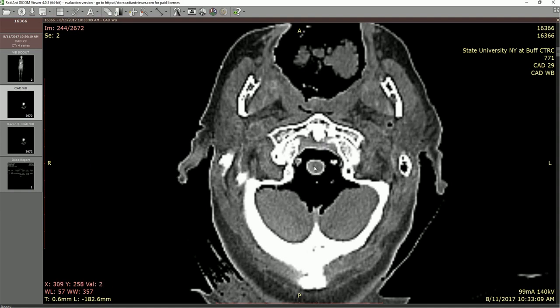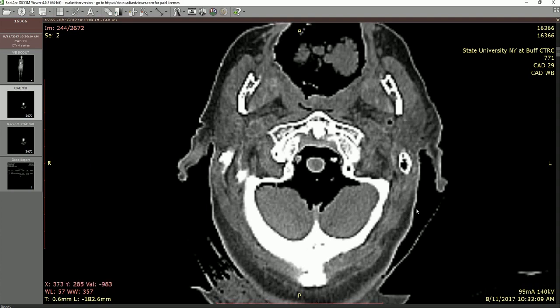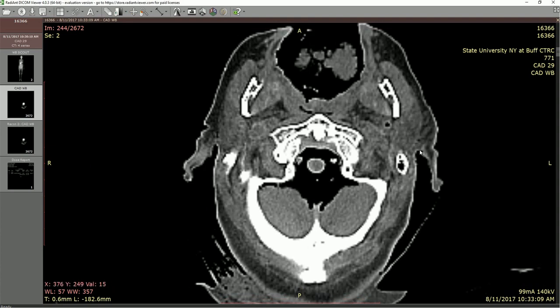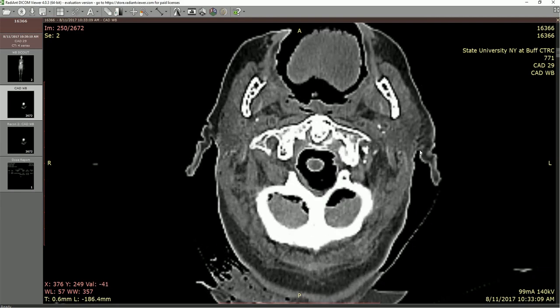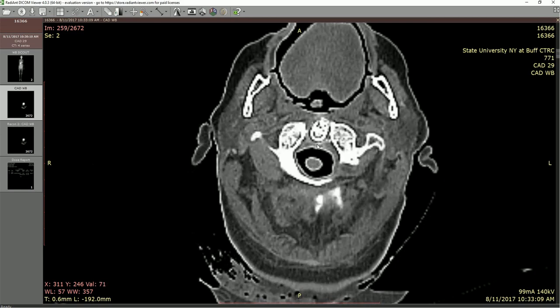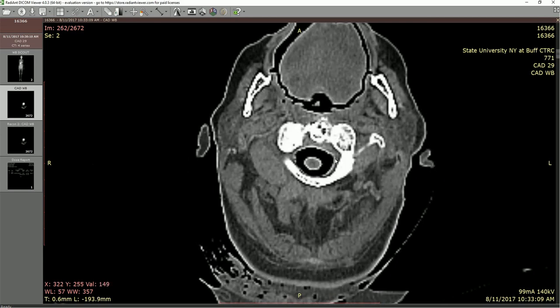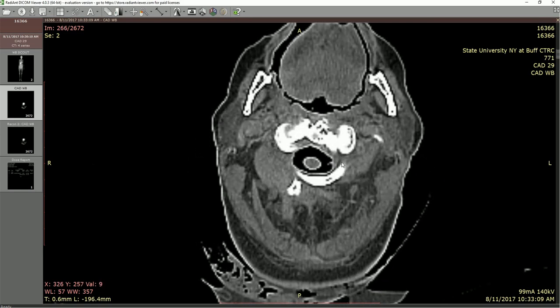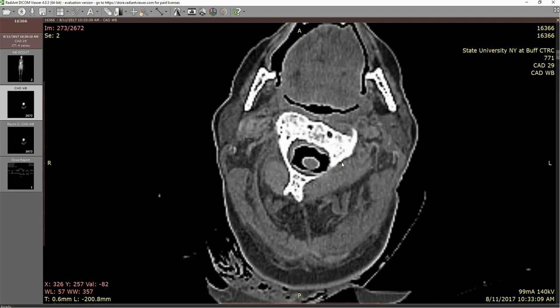We've got the spinal cord and brain stem showing within the middle here, and a bit of enlargement of the space as well, along with the posterior aspect of the occiput and a bit of the cerebellum. Moving a little bit further down, we can see more of the dens showing up, a bit more of that transverse ligament, and now we're seeing the posterior arch of C1.